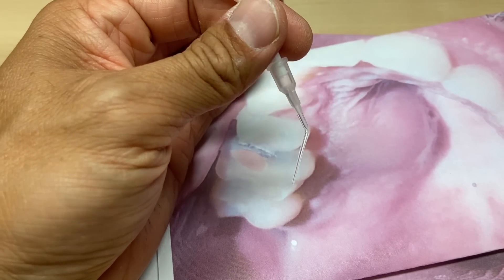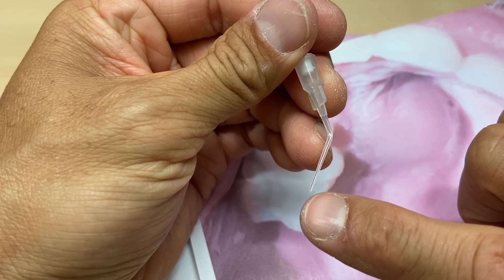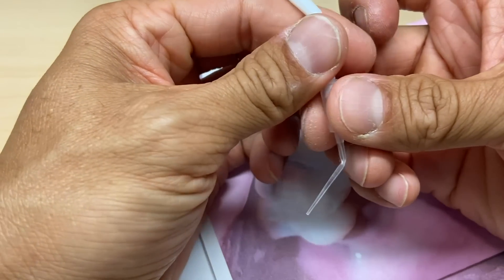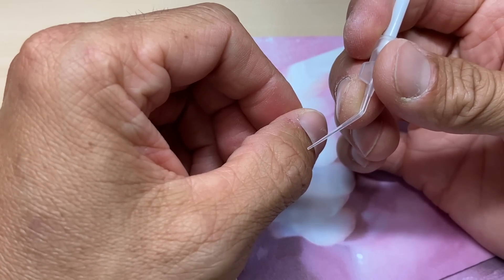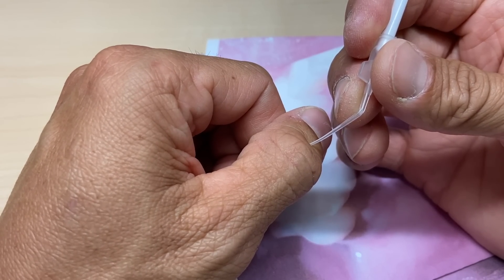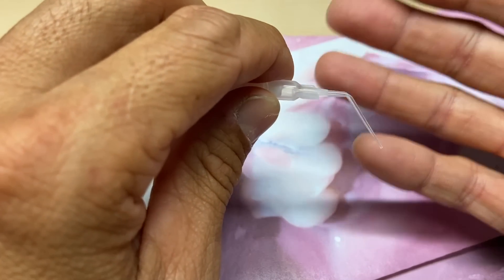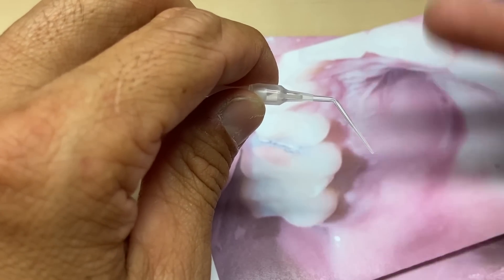The whole tooth is important, but we're specifically trying to get rid of that necrotic debris. The suction tip going down also helps remove necrotic tissue we can't reach with our file. What I love most about negative pressure in this situation: if the irrigant does go out the end of the tooth or gets constricted, the suctioning stops — so you know immediately you won't be pushing sodium hypochlorite out the apex. It significantly reduces the potential for a sodium hypochlorite incident.